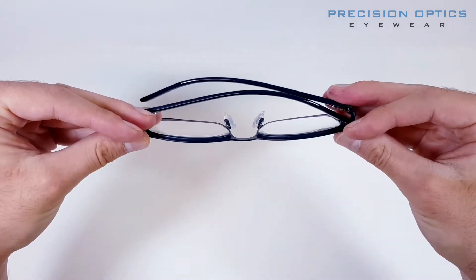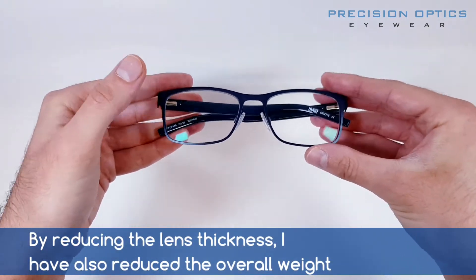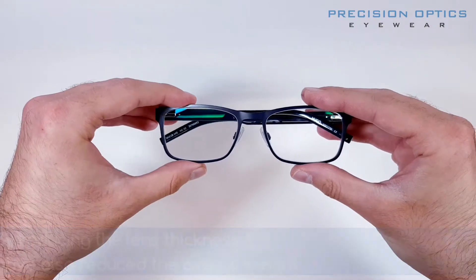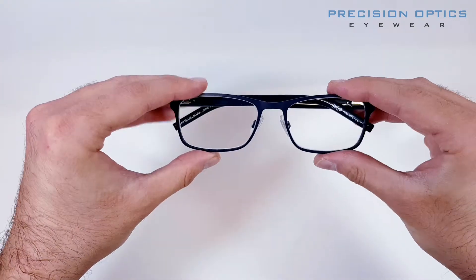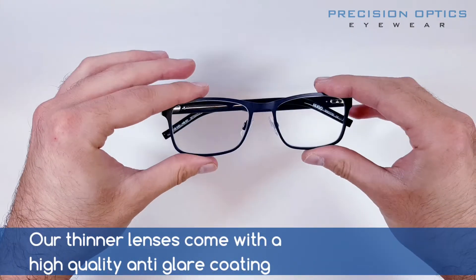The thinner light lens we've got here is 1.6 index, and as you can see they've come out really, really nice. In terms of thickness and weight, there's pretty much no noticeable difference in weight from when the frame came to us with no lenses compared to now. Weight and thickness wise, really happy with that.